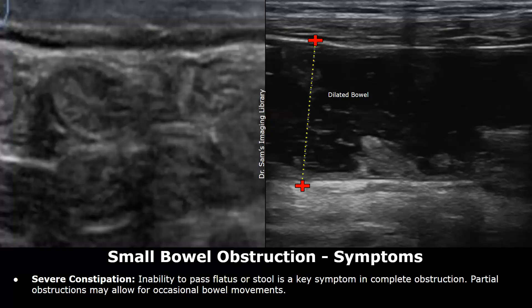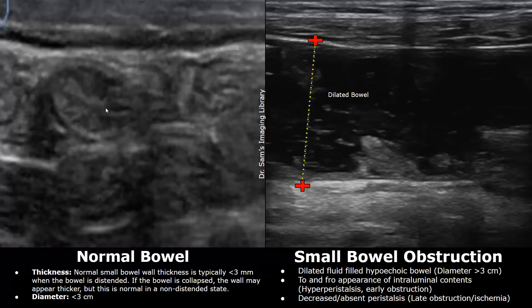Many patients with small bowel obstruction are unable to pass stool. Partial obstruction may allow for occasional bowel movements. We will now compare the normal image of the bowel with small bowel obstruction. This is the normal bowel — it appears collapsed, and you can see distinct layers. The normal small bowel wall thickness is usually less than three millimeters.